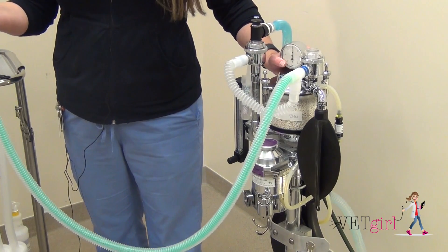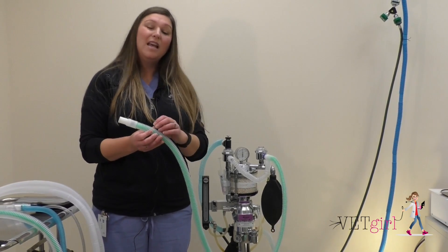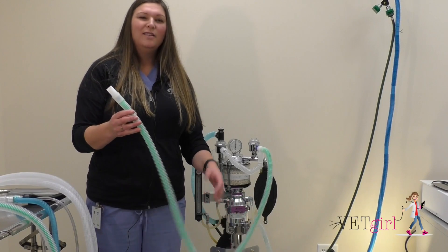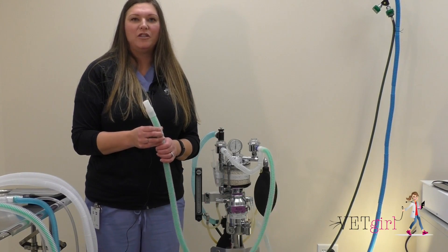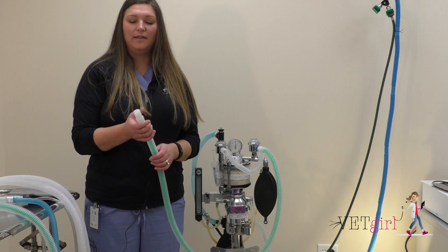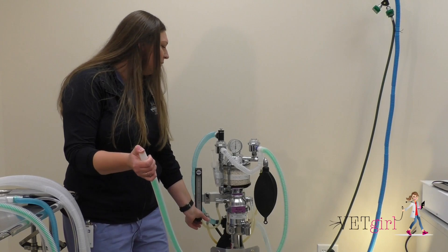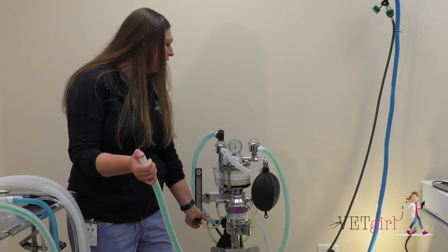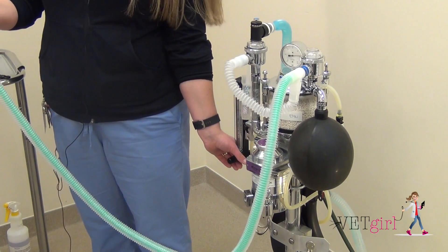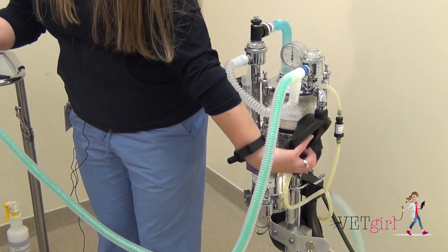The reason for using an F circuit is that the exhaled gases — the moisture and heat from exhaled gases — actually warm the inside tube that's providing fresh gas flow. So this helps maintain a little bit of heat and moisture for your patient better than the Y-piece. The pressure check is still the same: occlude the end of your breathing system, close your pop-off valve, apply pressure using your oxygen flush valve to above 20 centimeters of water, watch your manometer for any leaks, then open your pop-off valve and release the pressure from your reservoir bag out your scavenge.